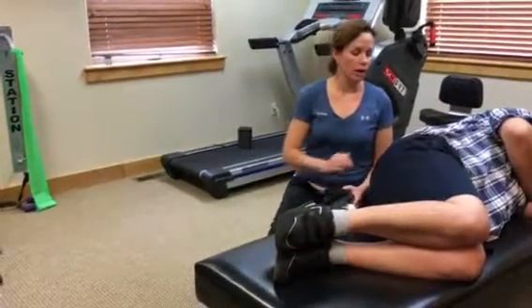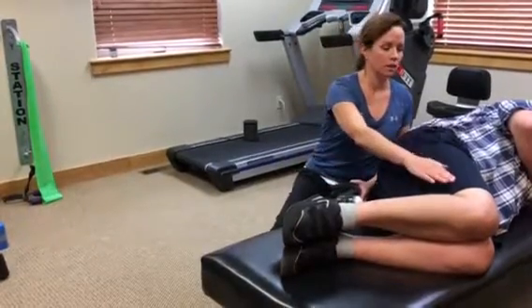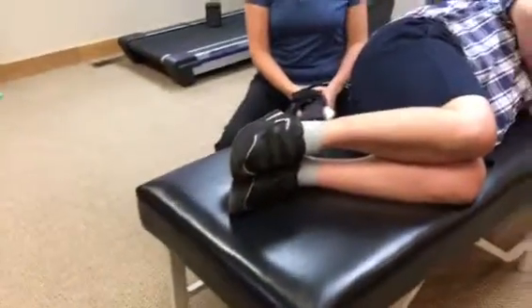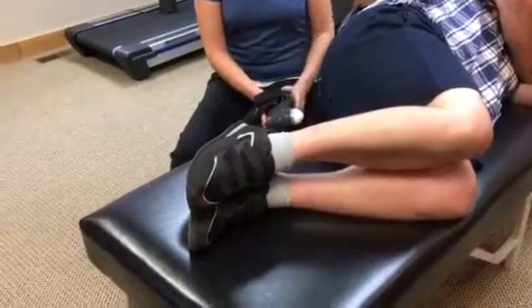So I just want to show you how the muscle is working before and after I apply the technique. I'm going to ask Jeff to go ahead and try to lift his leg up and down as well as he can with his own power. So go ahead and start trying to lift the knee up and down, and I want you to pay attention to the quality of the movement.